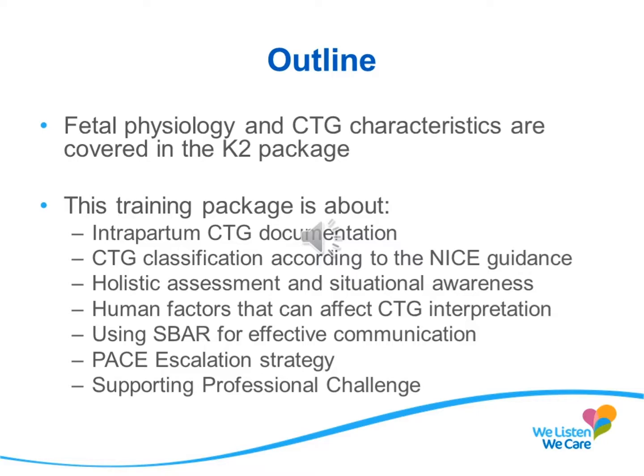The specific elements covered in this session are intrapartum CTG documentation, CTG classification according to the NICE guidance, the importance of holistic assessment and situational awareness when considering CTGs, and to raise our awareness of the human factors that can affect us when and how we classify and act on CTGs. We'll cover using SBAR for effective communication and the PACE tool for escalating concerns. We'll also cover supporting professional challenge.